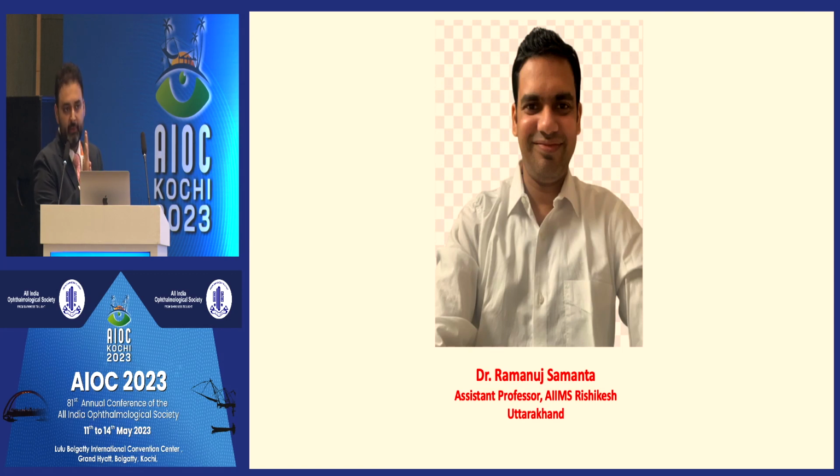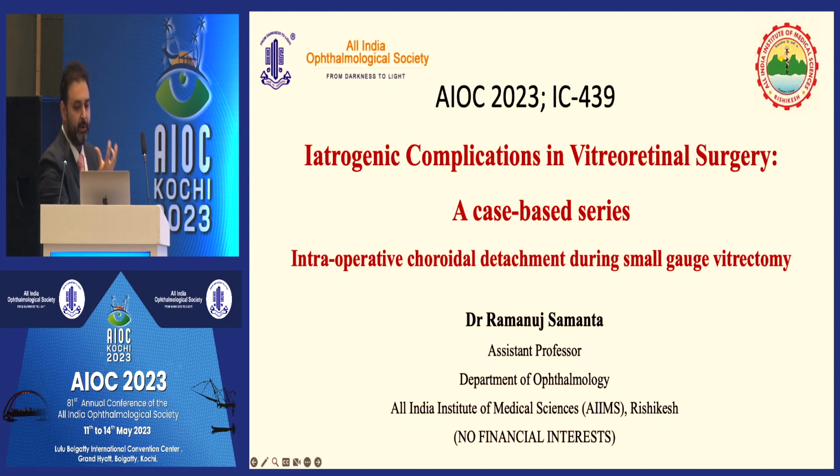And once you get emulsified oil under the retina, well, then that's a different kettle of fish. Tackling that becomes like PFCL, multiple bubbles. You can't get it out the way you do otherwise, and you can't keep doing lavages under the retina. So that is possible, although extremely rare, but a word of caution in cavitary optic disc anomalies.